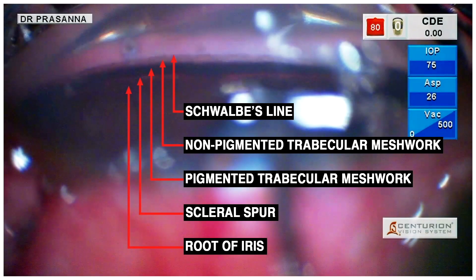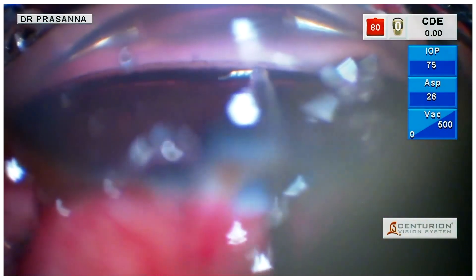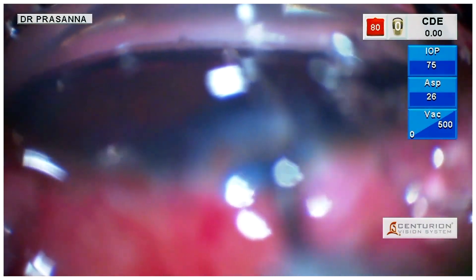Before implantation, it is imperative to identify the angle structures. Here we are implanting the G1 iStent into the trabecular meshwork with a proper gliding technique to ensure the proper placement within the angle.